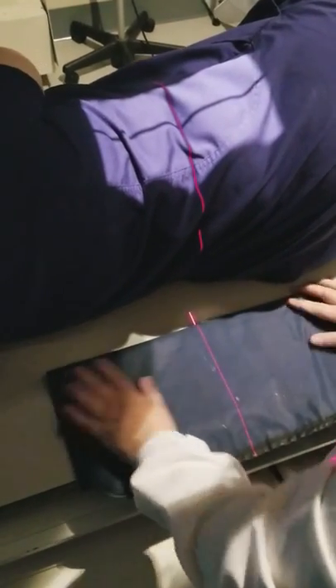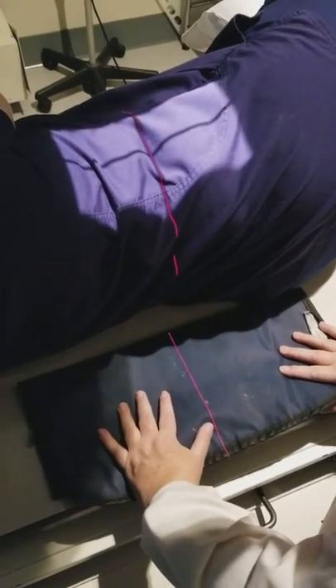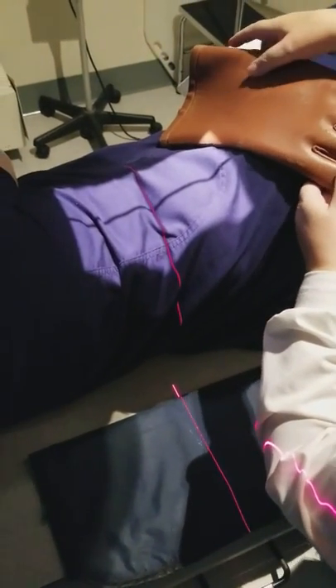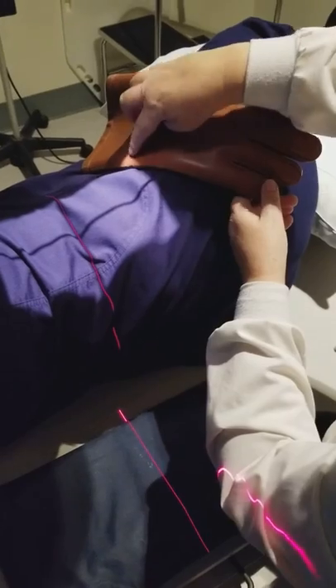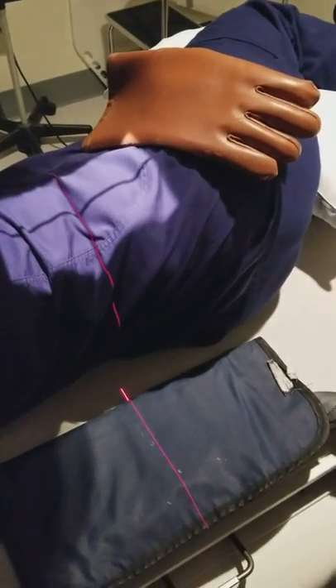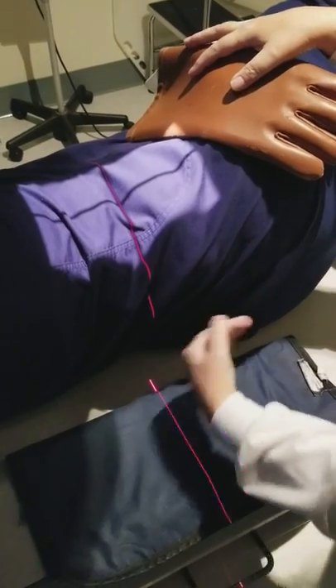She's rolling a little bit, so I'm going to get those shoulders back. I'm going to place lead behind her — not in so deep that it's going to be in the way, I just want to absorb any scattered photons. I can take any lead and place it across like this, just covering a little corner up here to show that I have shielded.